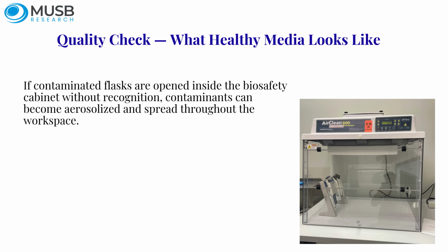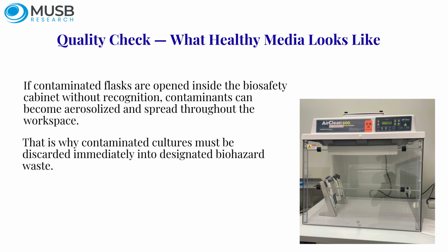If contaminated flasks are opened inside the biosafety cabinet without recognition, contaminants can become aerosolized and spread throughout the workspace. That is why contaminated cultures must be discarded immediately into designated biohazard waste.